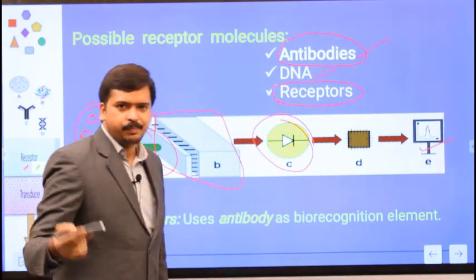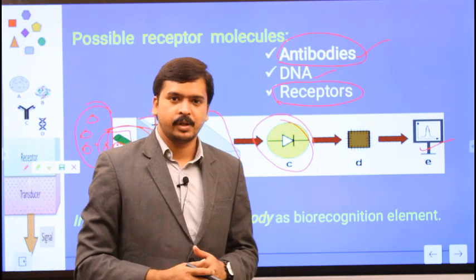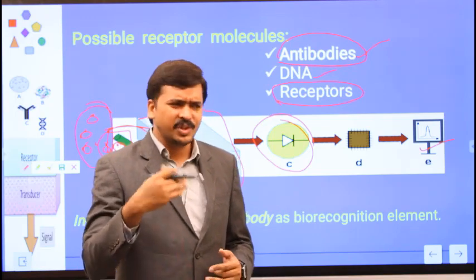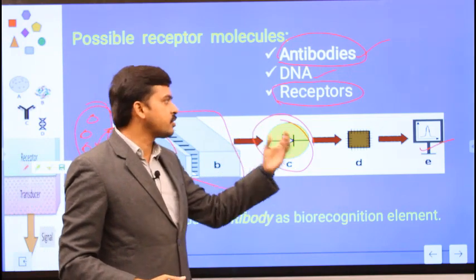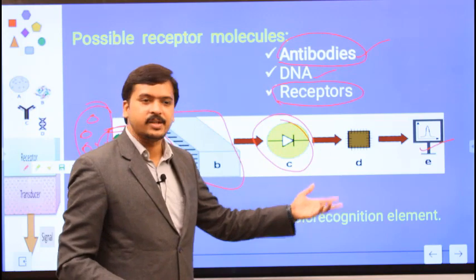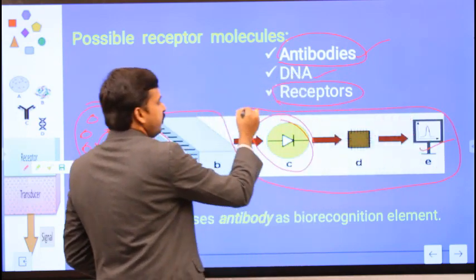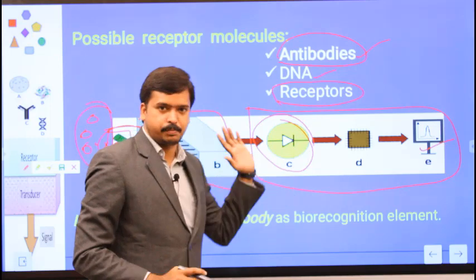So once it is displayed, it is easy to understand. A display is nothing but a readable output. It can be in the form of digits, or color, or words. It varies. In the latest ones you even see words, mentioning what stage or what level it is. All this you are able to see, but it all happens through converting and amplifying by the microprocessor and so on. But we are not touching that part.